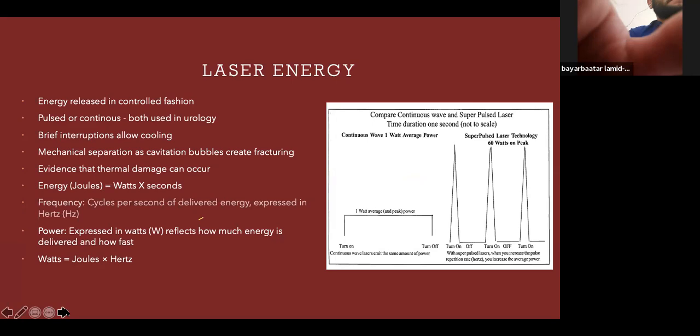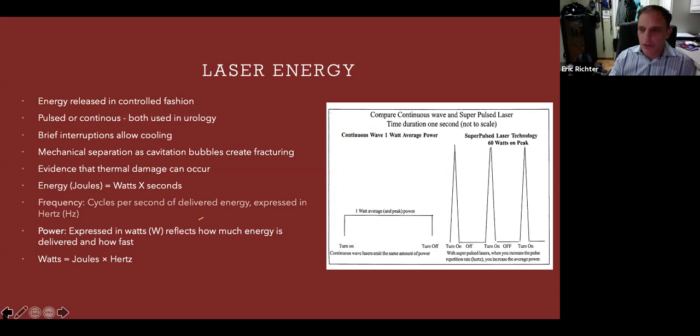Okay. So just before we move to the next slide, can you go back? I want to talk a little bit about that diagram. The laser you have is that 100 watt, high power laser. Essentially what creates that is the fact that those lasers are able to operate at very high frequencies. And that's what you can see with those spikes, and this is exaggerated, but those spikes with those periods of off, that it can go up and down at high frequencies, is what allows it to deliver so much power. And so you can see the diagram below where it's just a single pulse, continuous wave, that it can't deliver nearly as much power over time.